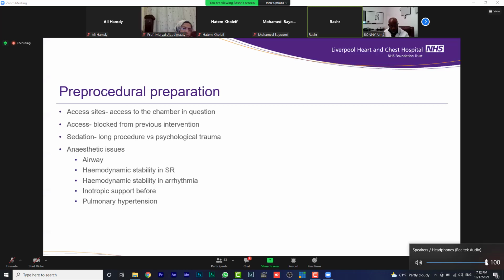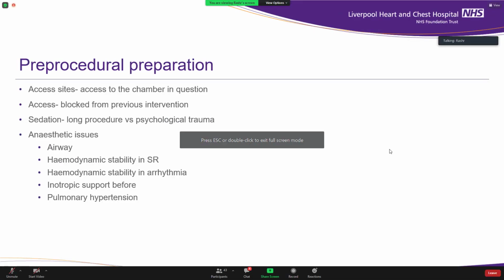Am I really going to be able to get far enough round? Will I have enough support? If my target is an outflow tract ectopic, that's a lot of catheter torque and you will struggle. So should you be going from the neck or from the subclavian?